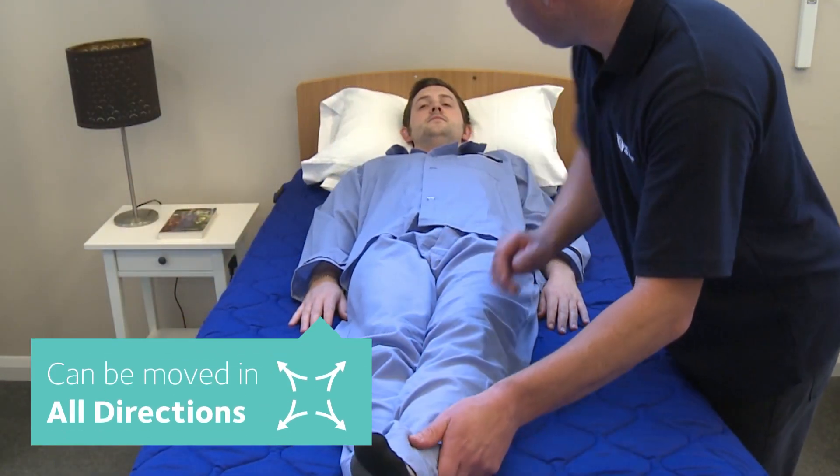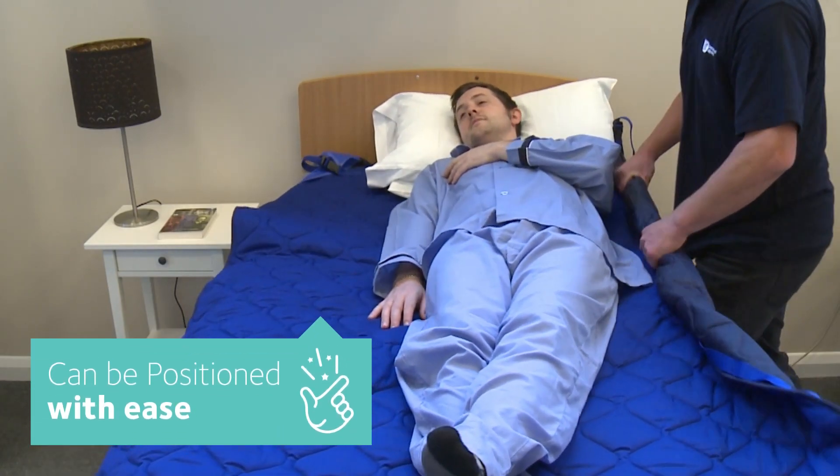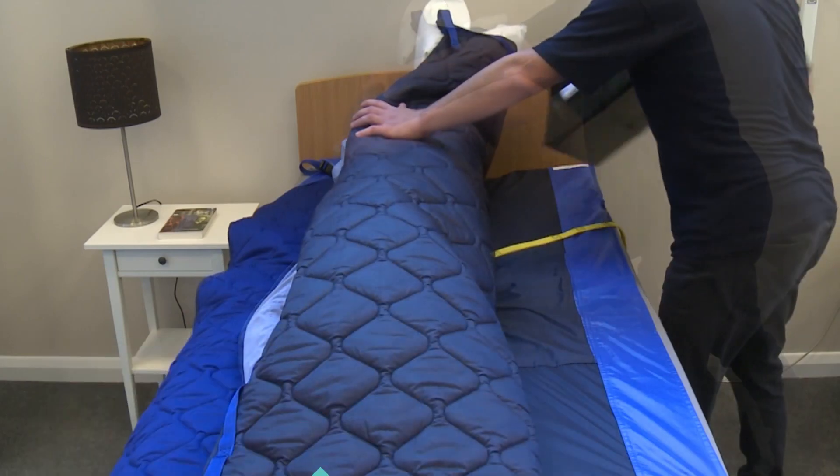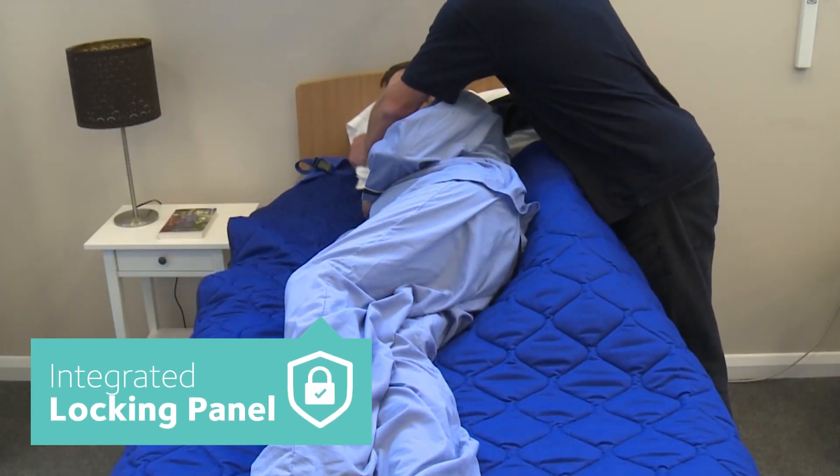The base cover is now slippy and you can reposition the client up, down, turn and rotate. If necessary, you can use positioning products to help pull down the slippy panel with the yellow handle. Repeat on the other side.